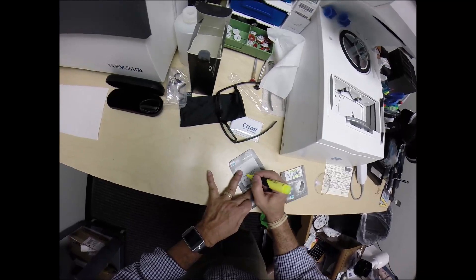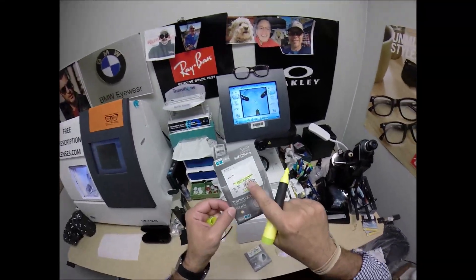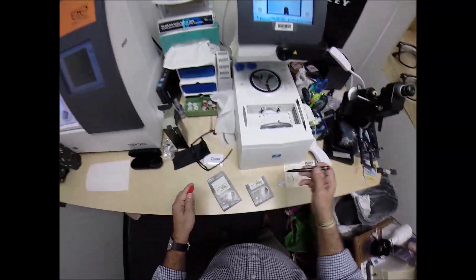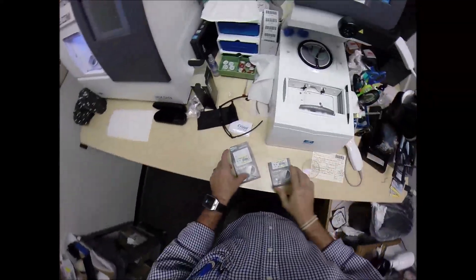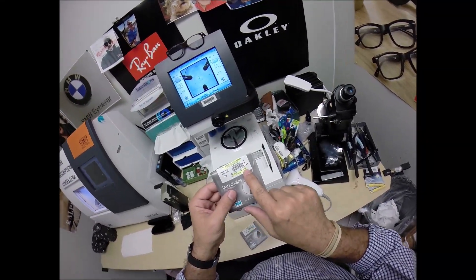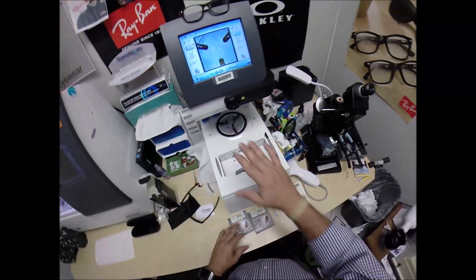That's the left lens — minus 2, minus 1. Transitions Generation 8. The Transitions Signature Generation 8 with Crozol Alize. This is the left lens. There are two different powers on here — one in plus cylinder, one in minus. Years ago they used to put the cylinder on the front of the lens; now they put it on the back, and that's why there's a minus sign.